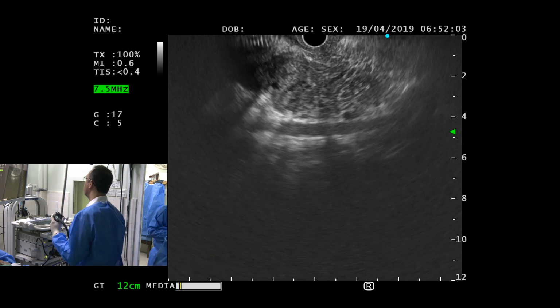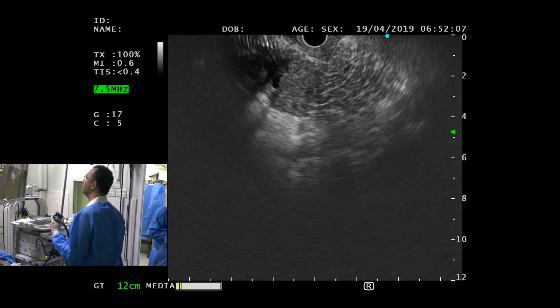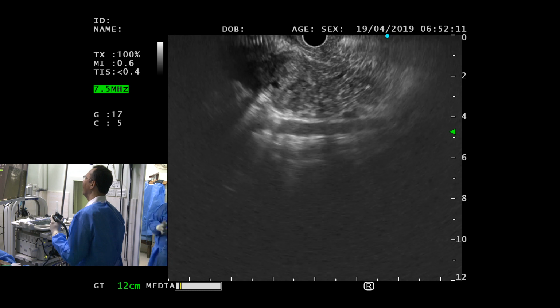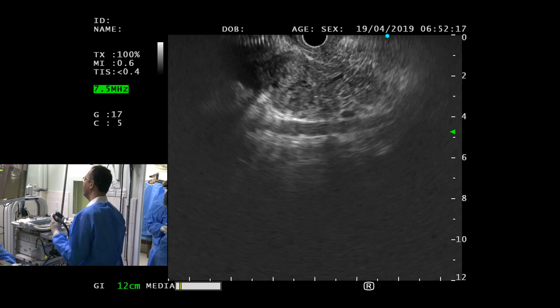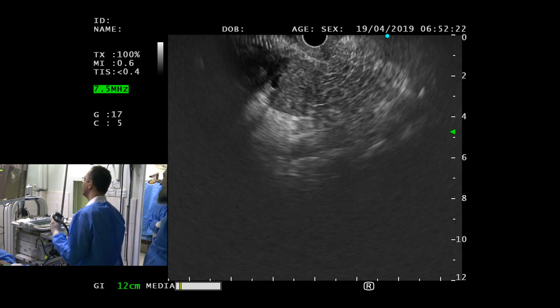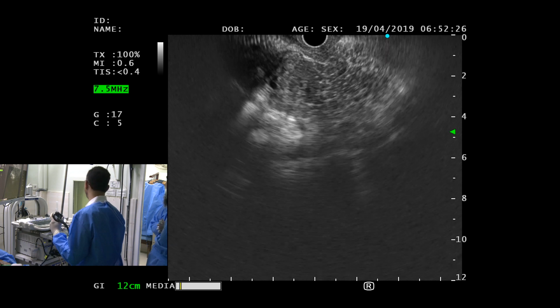Somebody is paying for the needle. So the house here, on my right, are the Western experts of Pakistani origin, and they feel that you've seen a mass, we're not sure what it is. Stick a needle, find out what it is. Okay, fine. On the left, they want to see how you do an FNA or FNB. So majority is the boss.